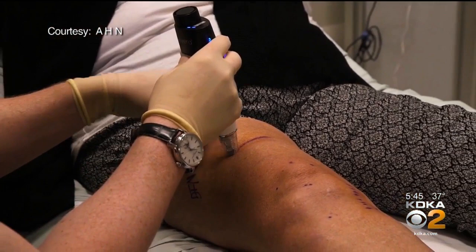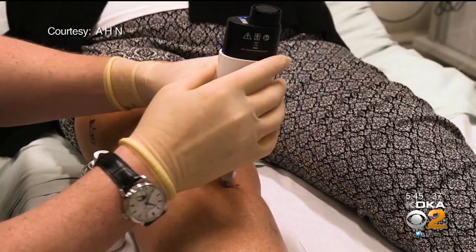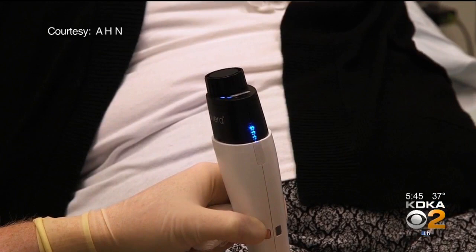Two weeks before the operation, it's a shot — but not steroids, a gel, or anything into the joint space. They do a series of injections above and below the knee, taking about 20 minutes, injecting nitrous oxide into the area around where the nerves run. It freezes the outside of those nerves, causing them to regenerate, which can take two to three months. While they're regenerating, theoretically they shouldn't be able to transmit as much nerve pain.